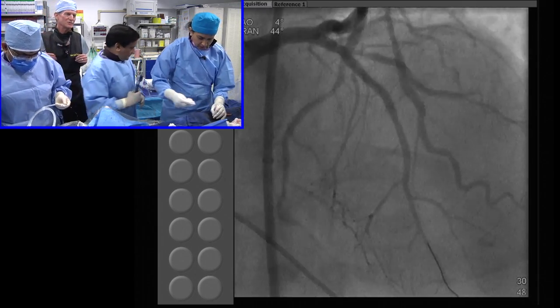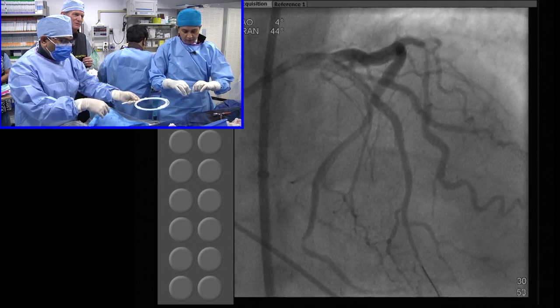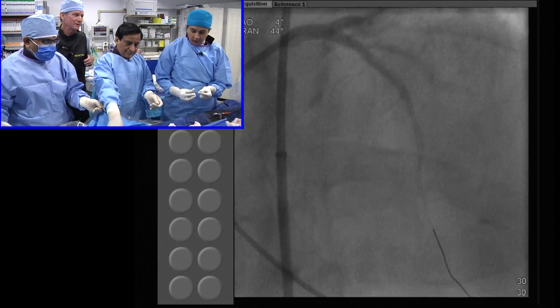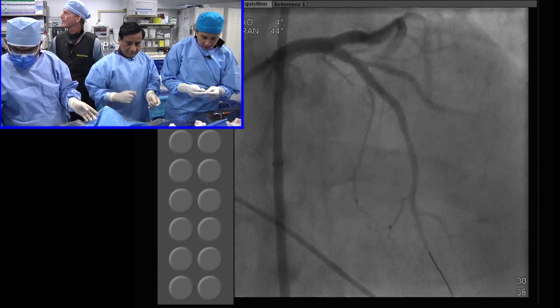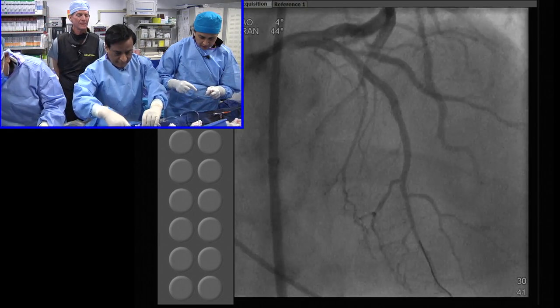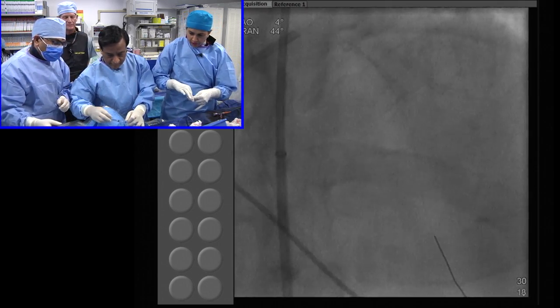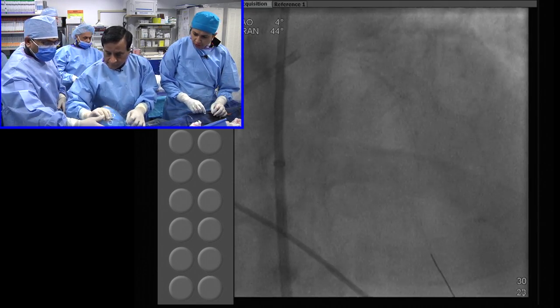You can see, Samir, probably even looking at the screen as you are, that visually you can tell the step up from that post-dilatation. Clearly a step up in lumen diameter compared to the immediate post-deployment. This is exactly what you want to see with Absorb. So angiographically, you would predict that with OCT we should see excellent strut expansion right through. Samir, how high did you go with the non-compliant? 20, for both distal and proximal. Excellent.